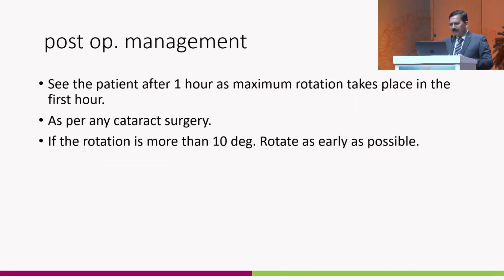And then post-op management: the first 1 hour is where the maximum rotation is supposed to occur. That's called the golden hour. So it's better to see the patient after 1 hour and ask the patient to lie down supine. I don't know to what extent it helps, but this is what has been advised. And the post-op management is as per any other cataract removal.